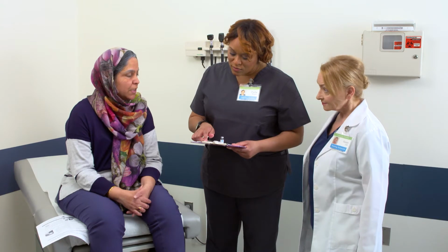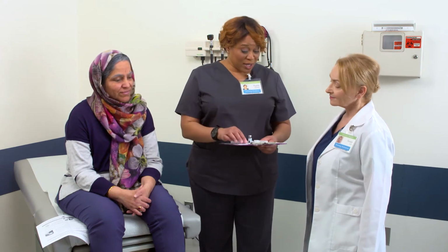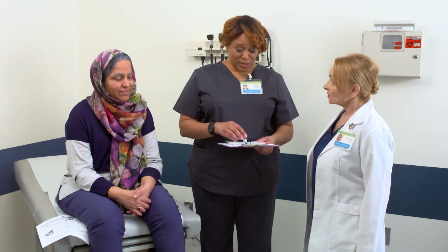No questions. Although being in the doctor's office is not fun, at least I'm leaving with a plan and I'll also be vaccinated against pneumonia. Good. Let me just check your identification. Can you state your full name and date of birth for me? Mrs. Farzana Khan, May 23rd, 1950. Great, thank you. I'm going to check the medication label for the third time really quickly.